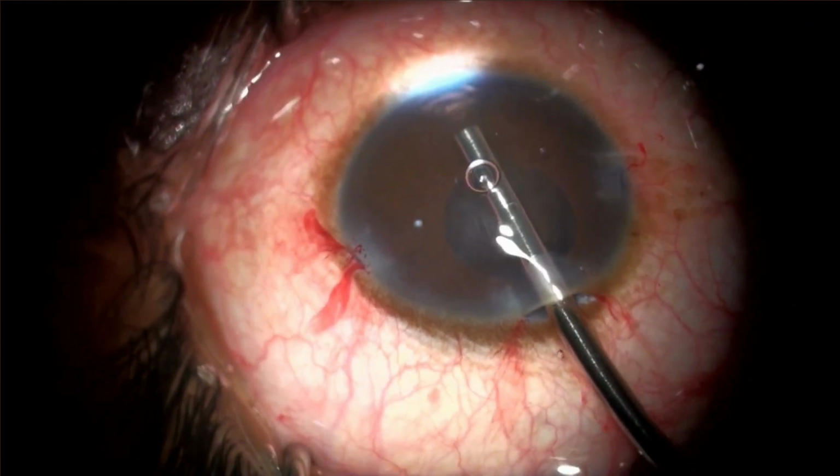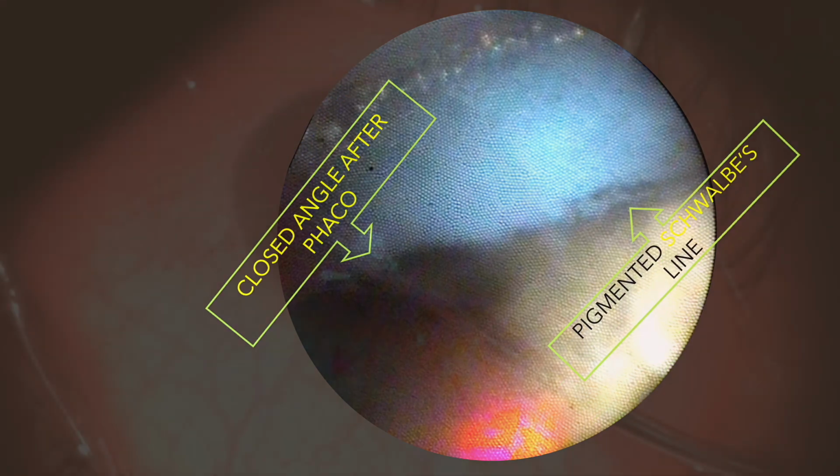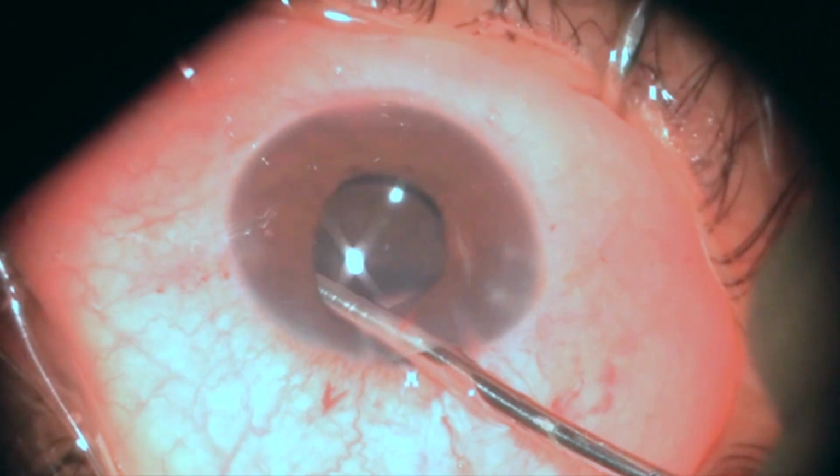Here in this case, it appeared to be almost completely closed even after phaco. Following this, the endoscope was introduced into the sulcus and the ciliary processes were visualized. Delivery of the laser was under direct vision and it was aimed at the tail of the ciliary process, the end point being whitening and shrinkage of the ciliary body posteriorly away from the iris.